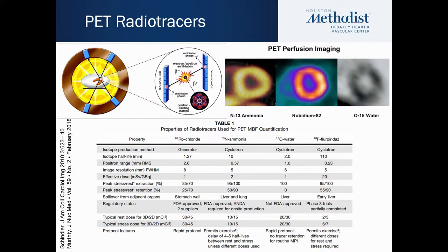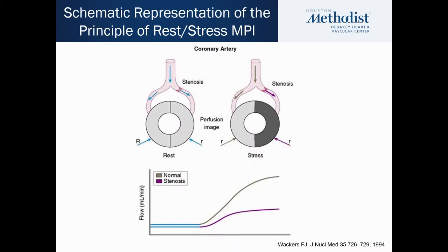And that's why we're not able to exercise patients, and we really have to have a generator on site where we can administer the drug right away. Because of its very high energy photon, you can get, we've heard Dr. Al-Mallah's talks of how good image quality is with PET imaging.